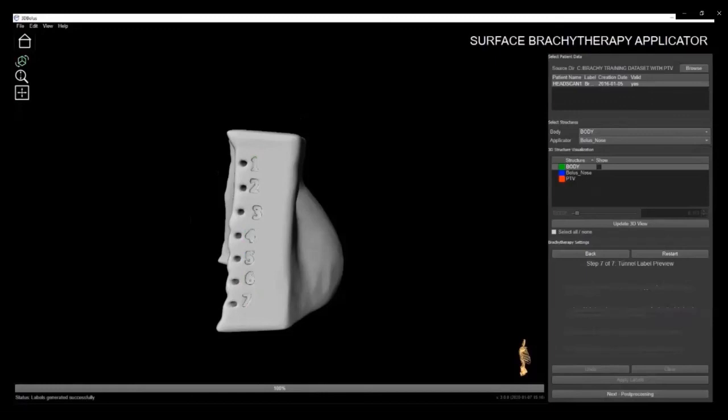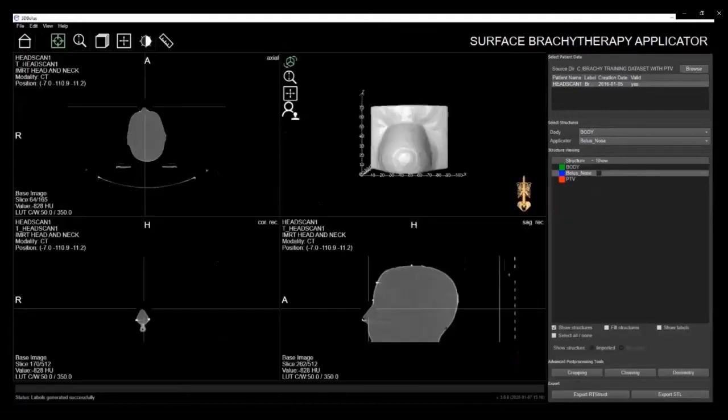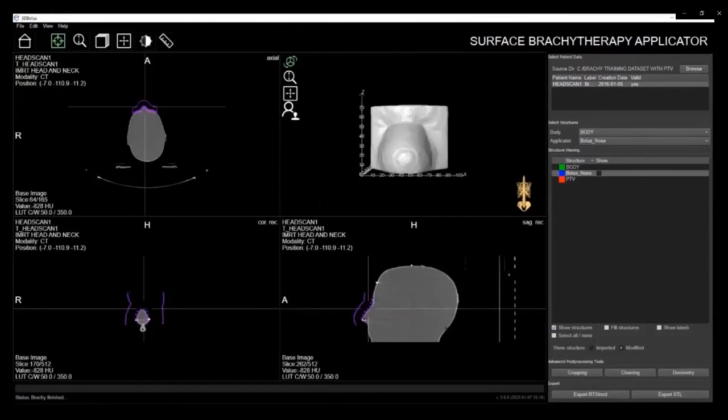It's important to know that any of these steps can be skipped if not required. You simply click Next and move on to the next step. Now the applicator design is complete, and you can continue with the approved workflow, which includes printing the applicator, scanning, planning, and treating the patient.